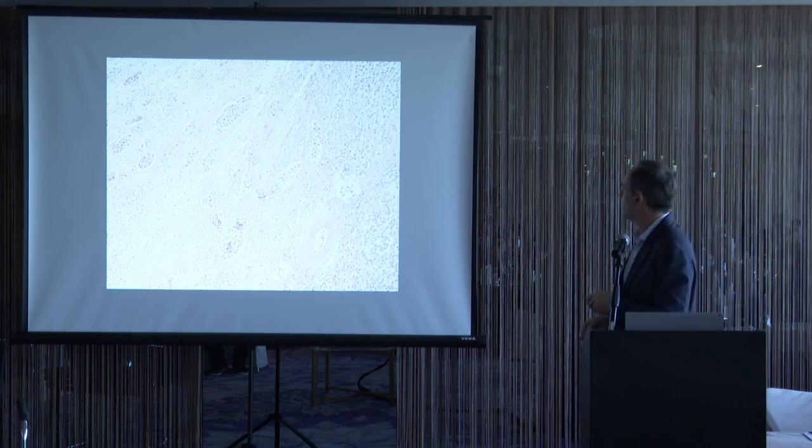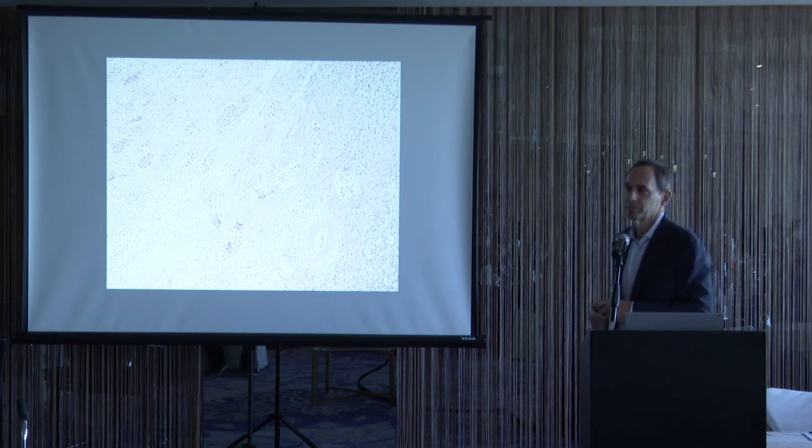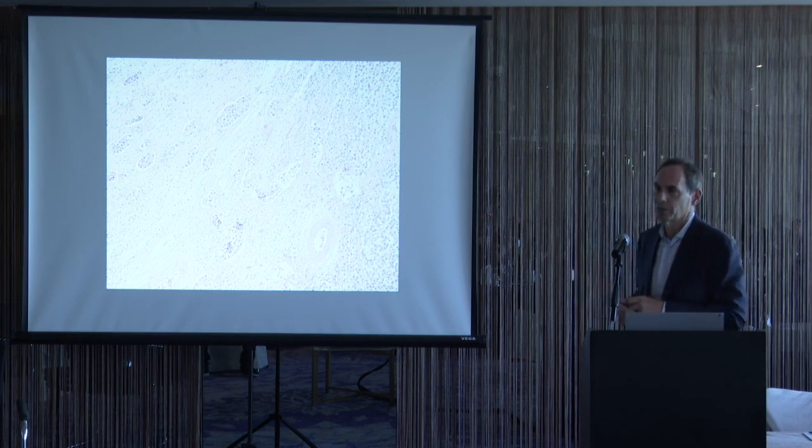Yes, the reason why this is not artifactual is if it was artifactual, they wouldn't be these rounded nests in here. It would be more just loose individual cells. So something like this could be artifactual, I'm not sure. But the fact that these are more cohesive, rounded structures, to me indicates more that these are real. And should we do CD34 or factor 8 to identify the vessels? Yeah, if you're not sure that these are true vessels versus retraction, absolutely. You could do an ERG or CD31 or 34, absolutely.